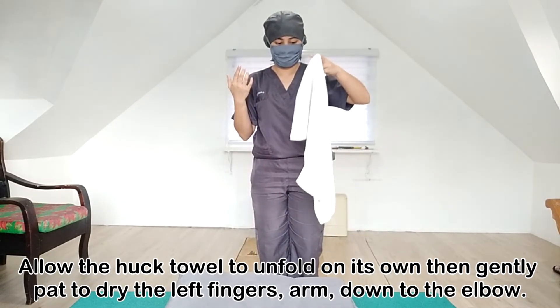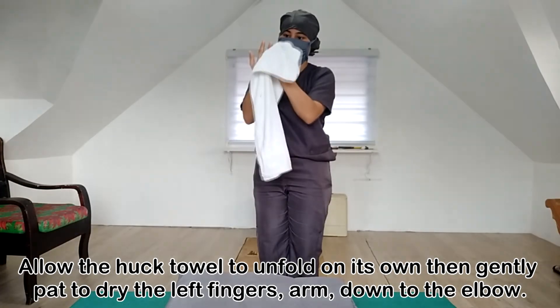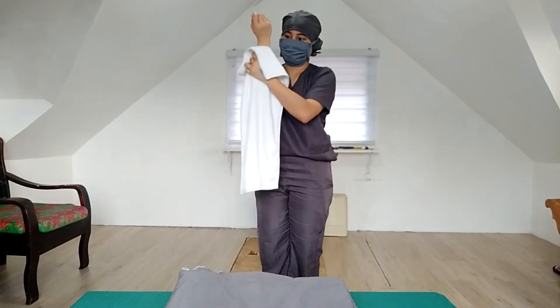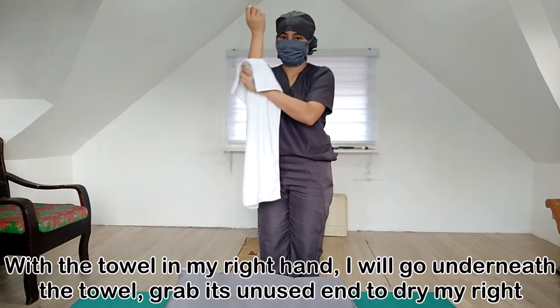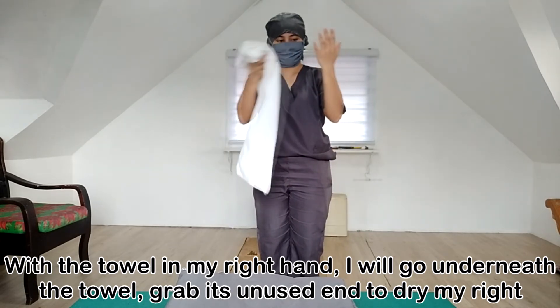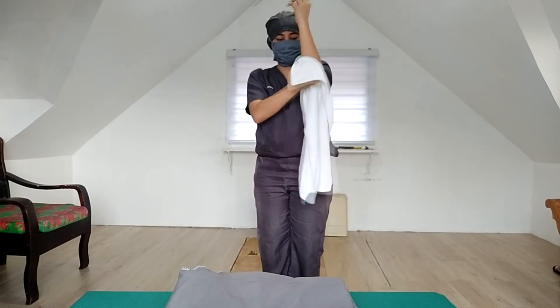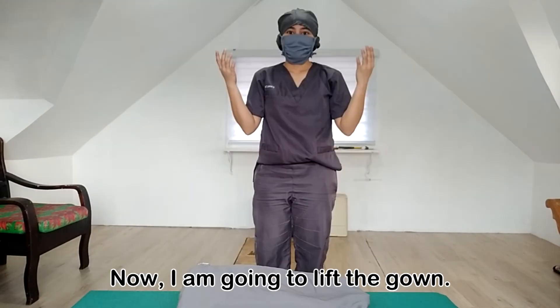Allow the towel to unfold on itself and then gently pat to dry the left fingers and arm down to the elbow. With the towel in my right hand, I will go underneath the towel, grab its unused end to dry my right fingers, arms, down to the elbow. Discard the towel by giving it to a member of the non-sterile surgical team.